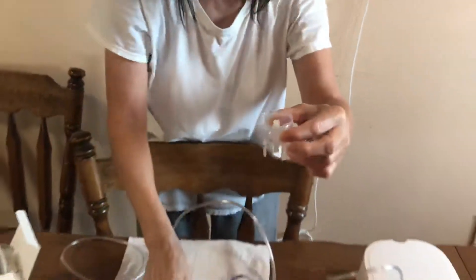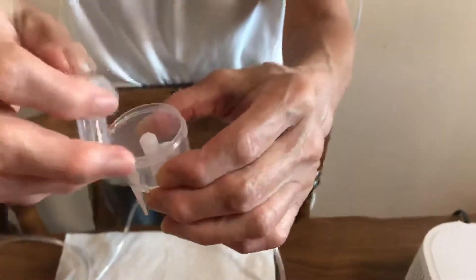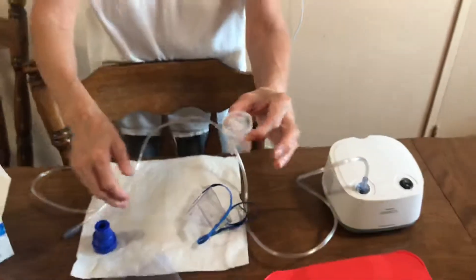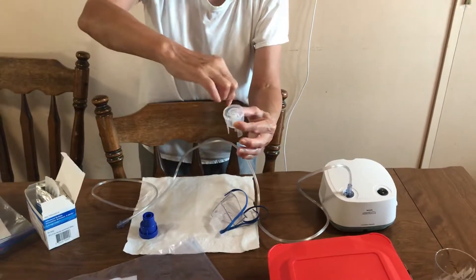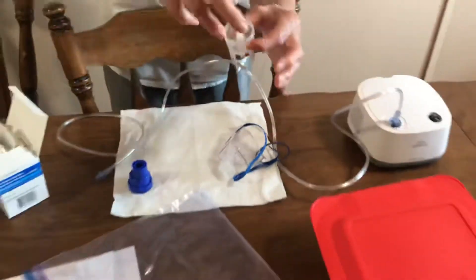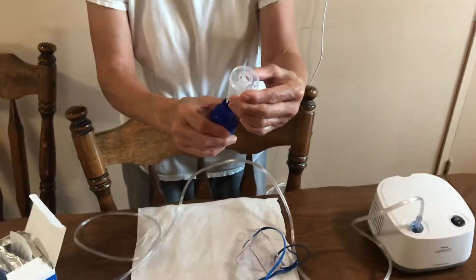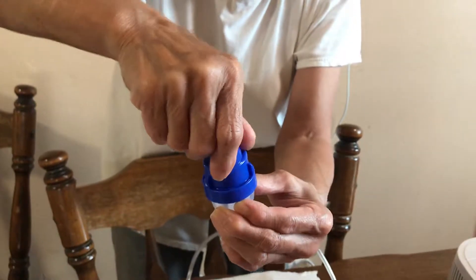This little plastic piece here goes on top like that. It comes out like this. You put that on top and then you put the medicine in the little basin. Then this part goes on top and you twist it to close it.